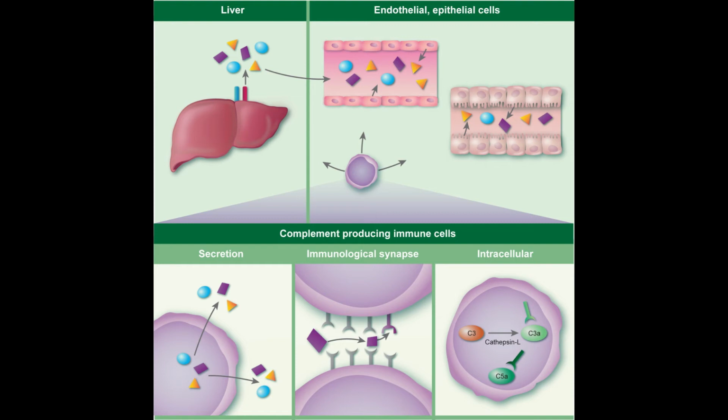The use of controls is extremely important to ensure the accuracy of test results. This includes running known positive and negative sera, an antigen control, a patient serum control, a cell control, and a complement control. The antigen and patient serum control test for the ability of complement to bind in the absence of antibody. This control shows lysis with the sheep red blood cells.